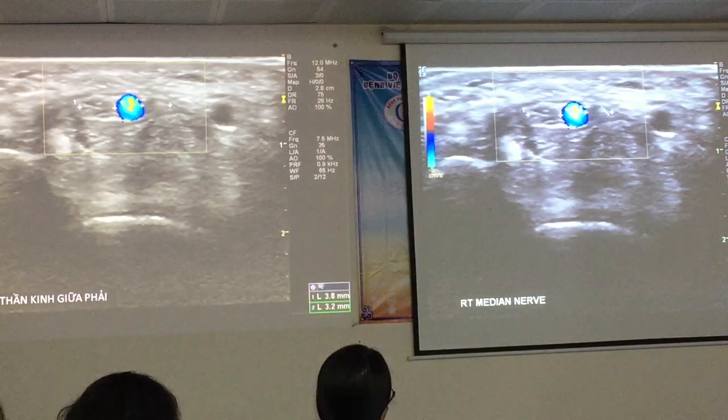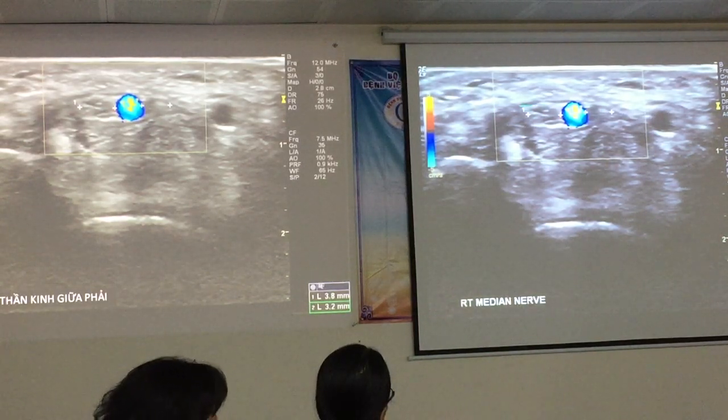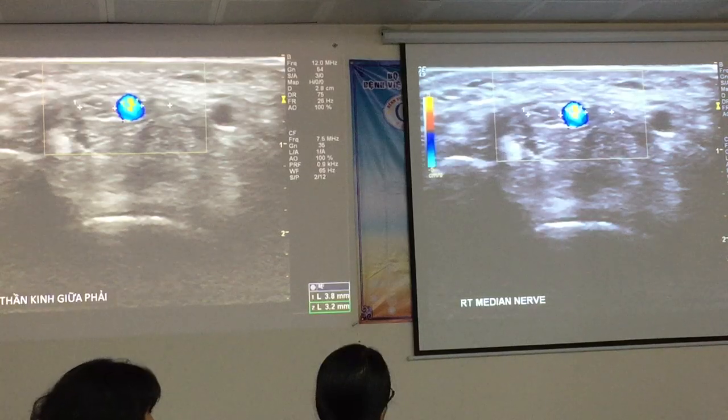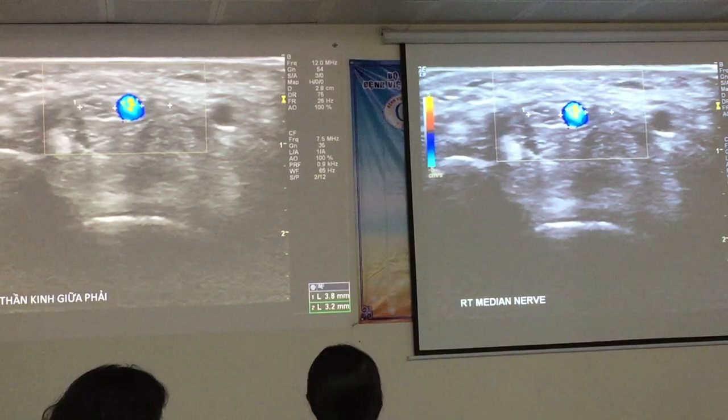So this is an important finding to relay to the treating surgeons because they don't want to go in and unexpectedly hit this little artery when they're trying to separate the retinaculum. So it's important to mention this. Đây là một cái cấu trúc quan trọng mình phải biết để đối với phẫu thuật viên người ta không có muốn điều trị sai.